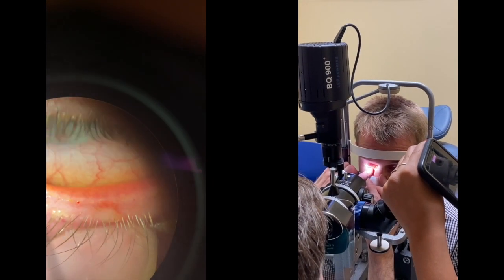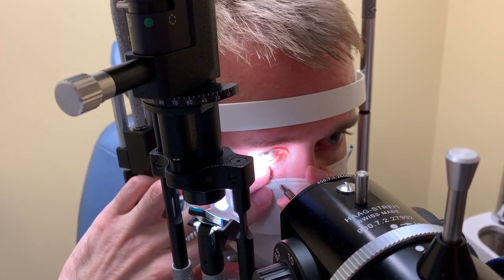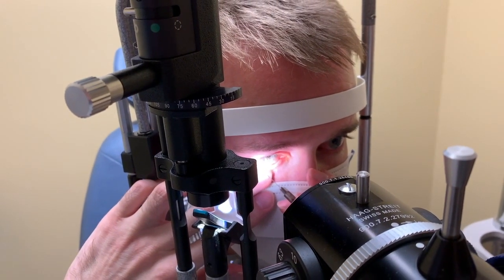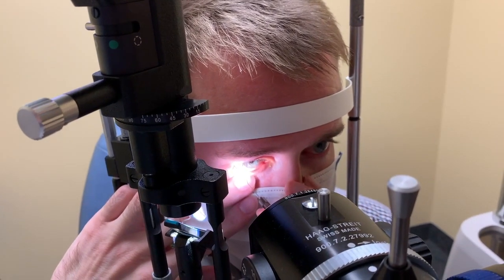For numbing I usually numb only the eye with proparacaine. This makes it possible to pull the lid away without too much discomfort. It is very difficult to numb the lids themselves without an injection.